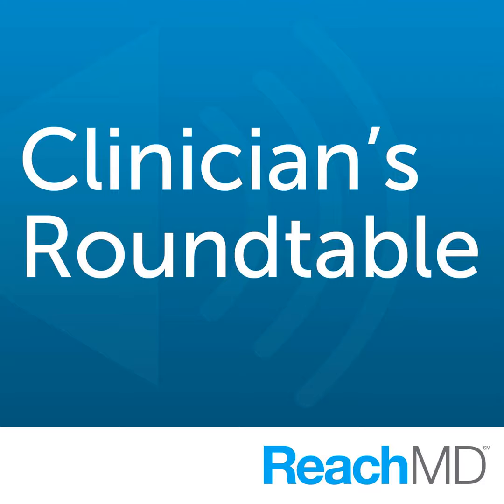Today we are discussing virtual reality simulation in carotid stenting. Dr. Cates, how do you begin a virtual reality carotid stenting procedure? Well, the first thing that is required to actually practice the procedure prior to doing it, a type of technology we call mission rehearsal, is that you must get a CT angiogram or MR angiogram of the patient's anatomy from the aortic arch up through the carotid. And why do you do that? You do that so that you can load that digital information onto the simulator so you can actually practice the technique in your own patient's anatomy.